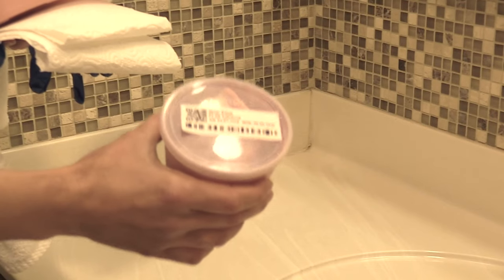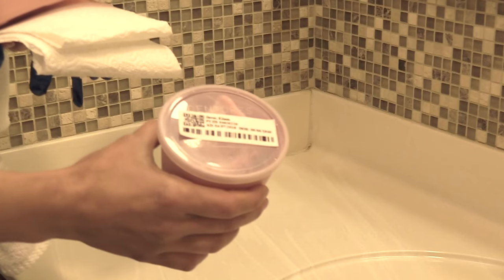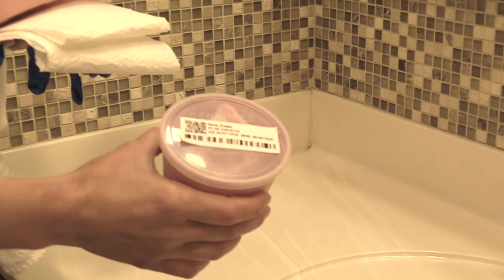You'll want to perform hand hygiene and don gloves, then assist the patient with removing their dentures. Our patient has removed their dentures and we've put them in the denture cup with the lid on. We've doffed gloves and performed hand hygiene, and now we're at the sink area.